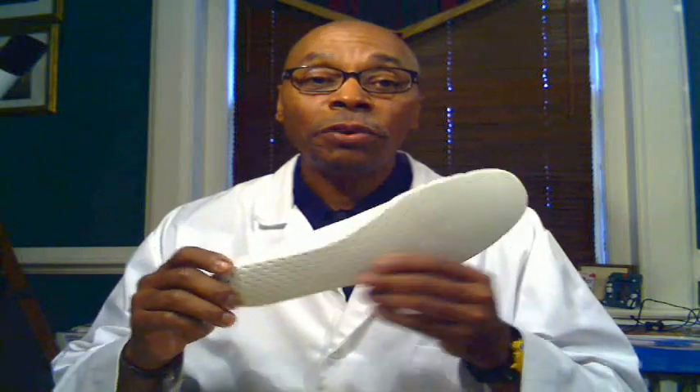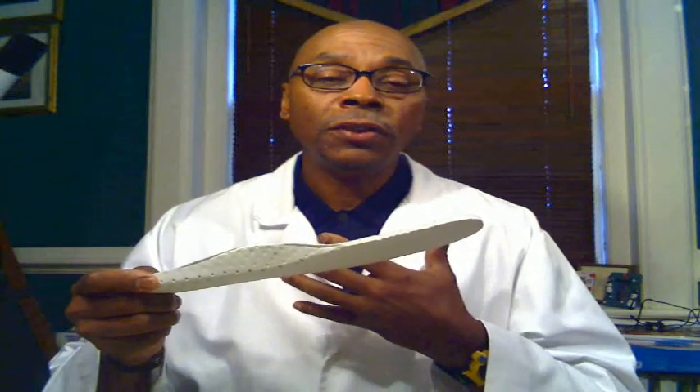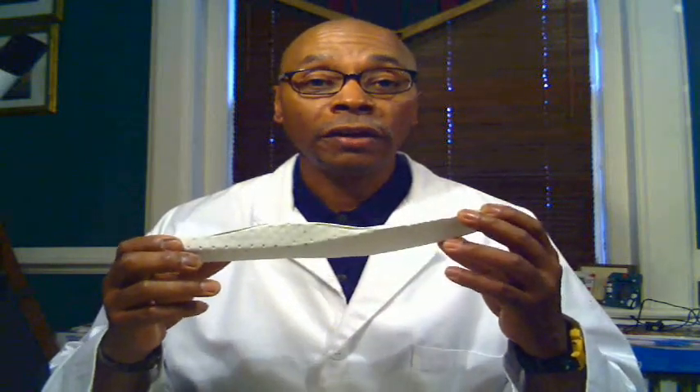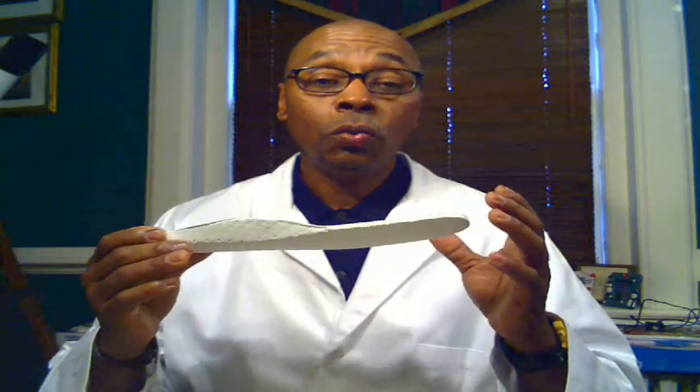Most shoes come with a device like this — this is an insert, taken out of one of the shoes here at 360. It does not provide the type of support that one would typically need to obtain the biomechanical benefits that would help minimize or prevent certain foot-related conditions. This device is actually designed to give you some cushioning effect. It cannot manipulate or alter the position of your feet or redistribute your weight in any way. It's basically rubber — very flexible — so once your weight is applied to it, it basically just flattens out. Its main use is to provide your feet with a certain level of comfort and cushioning.